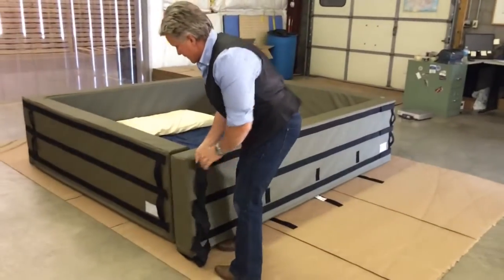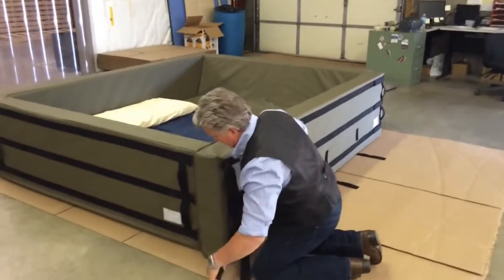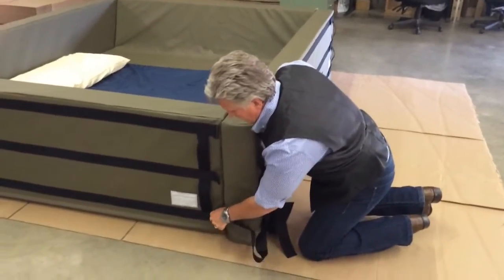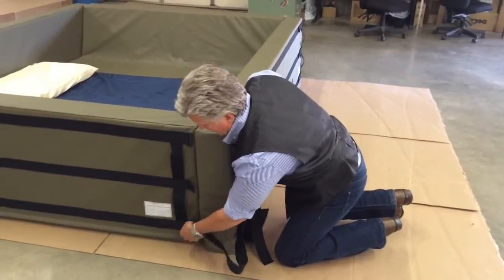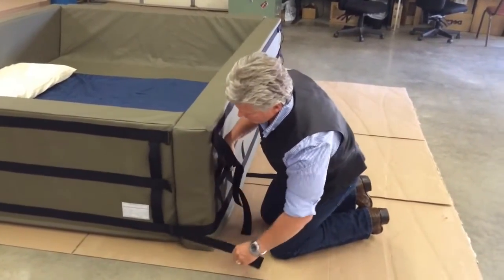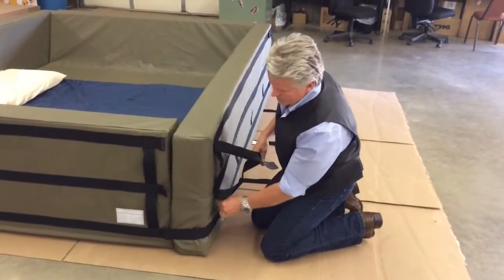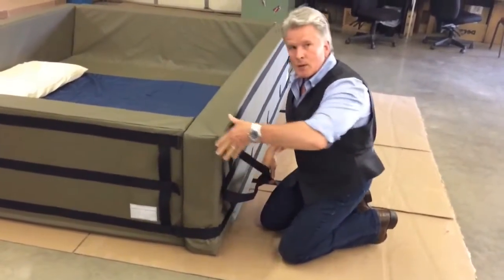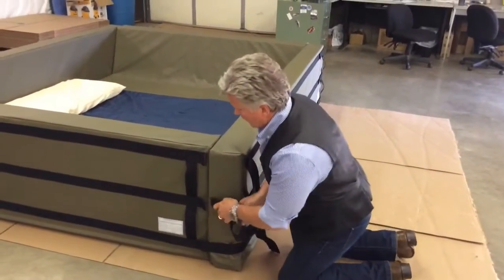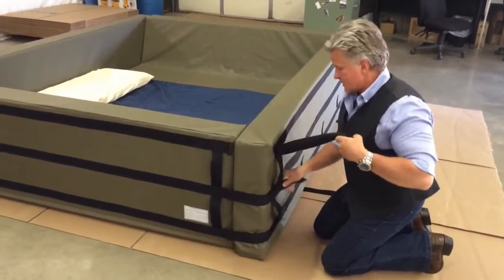Nursing staff can close it up, and it goes together via the buckling system, and that allows us to cinch it and draw it tight, and it's in place. The force, because we're coming around a 90-degree angle, is very, very strong, much stronger than Velcro alone. Each one goes in place.